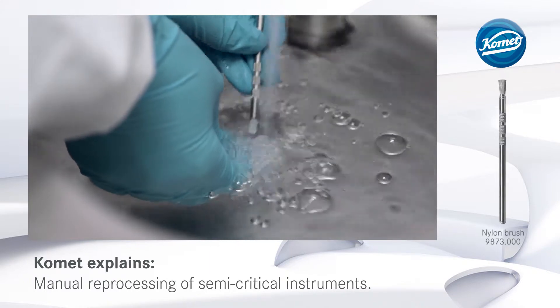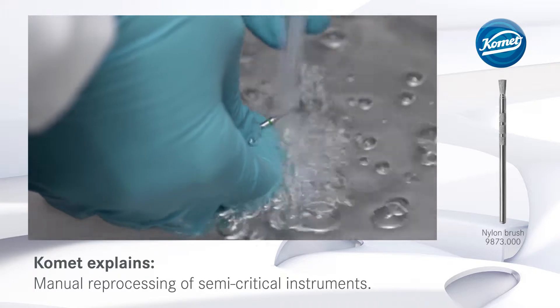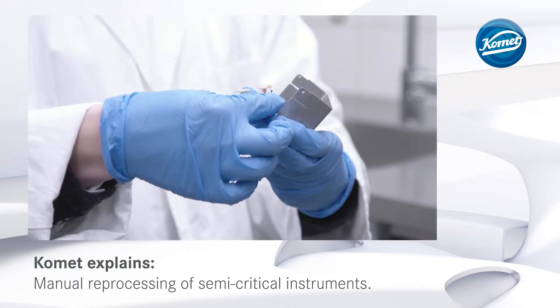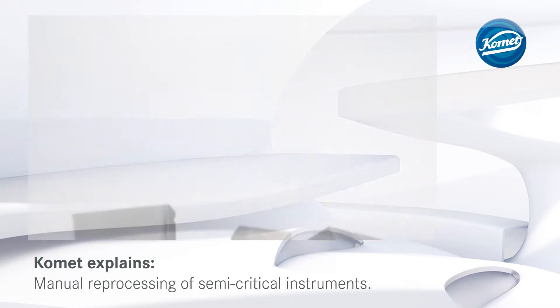Once the pre-cleaning step has been concluded, the rotary instruments are thoroughly rinsed under running, demineralized water. After that, they are placed into a suitable burr block for neat storage during reprocessing.